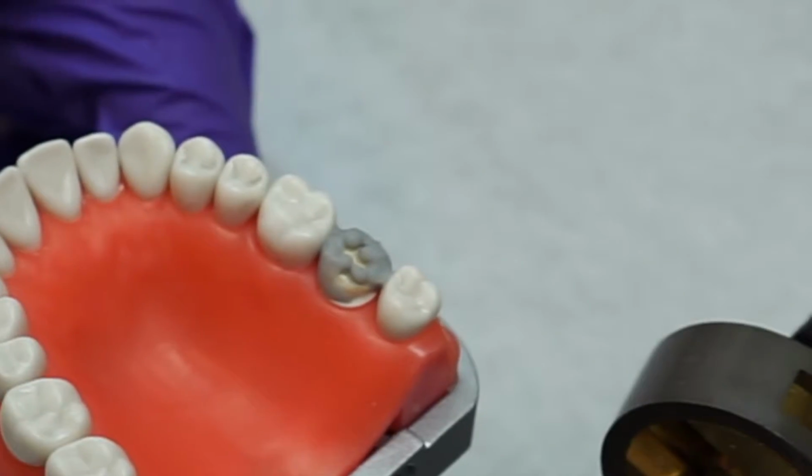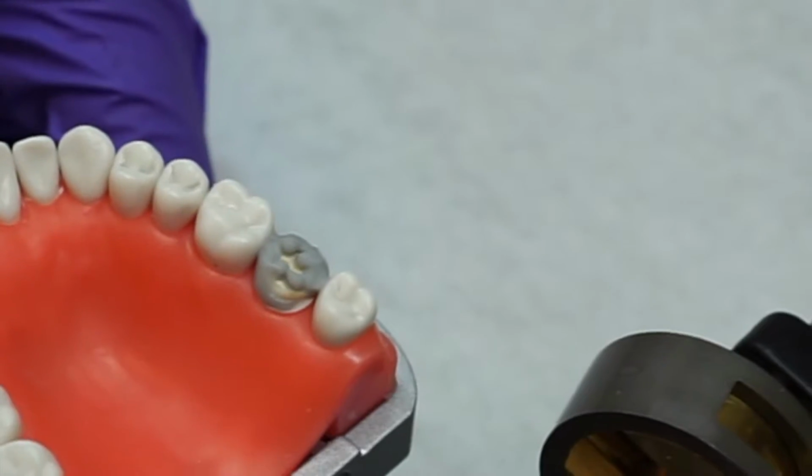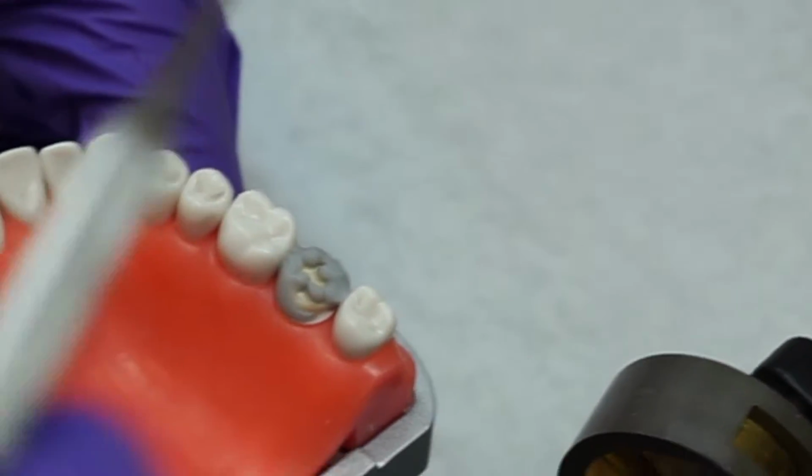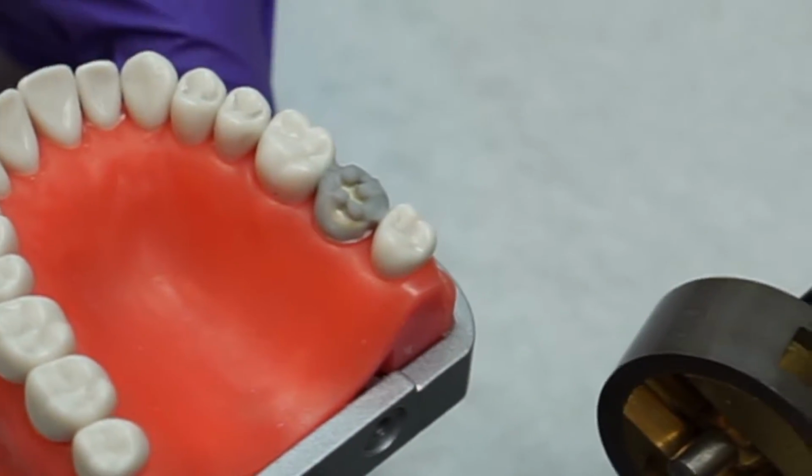Now, let's move on to the palatal aspect. This time, create the outline at the base of the tooth in wax, and then flow that into the interproximal contacts.